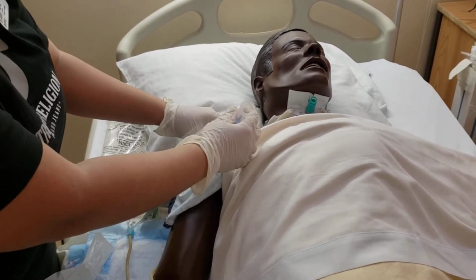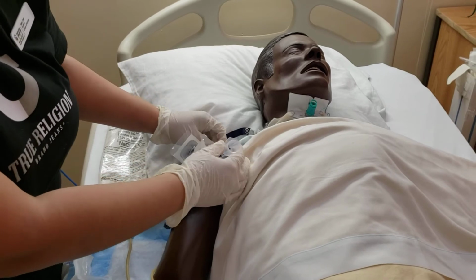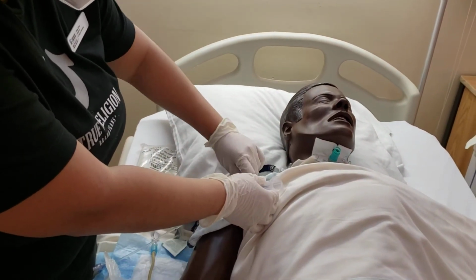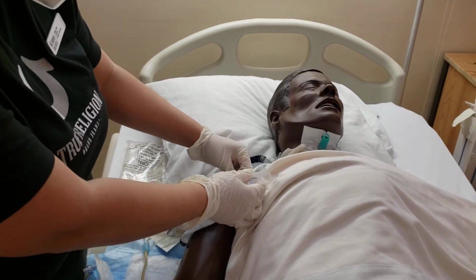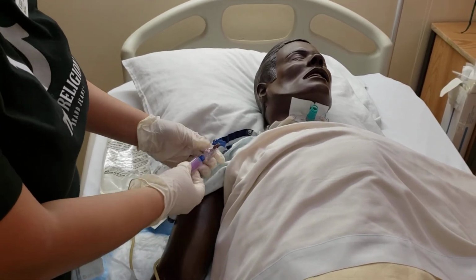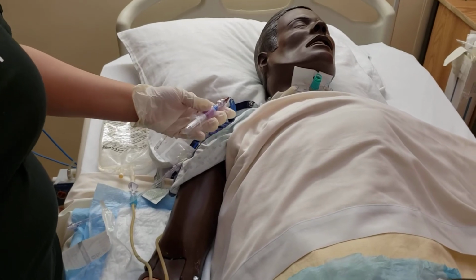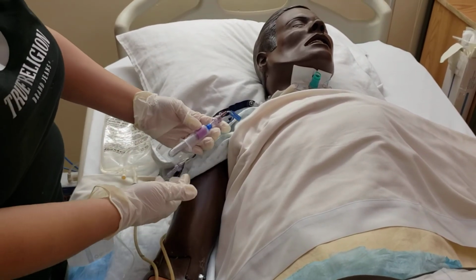Also, I would do this in the beginning, before I even access the CVL: I would make sure that all of the clamps are closed. So all of the clamps are closed right now. And then I would connect my blood tube onto my vacutainer and then unclamp my line. In real life, the blood tube would automatically fill itself with the amount of blood that it needs. However, our mannequin doesn't have a blood pressure. That's why it's not filling, but in real life it would.